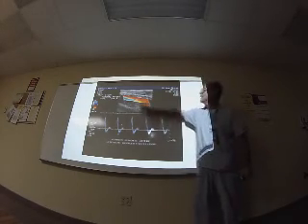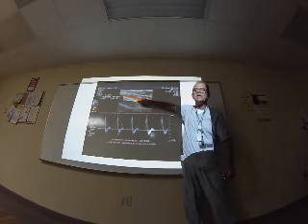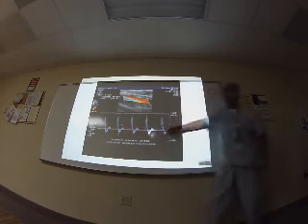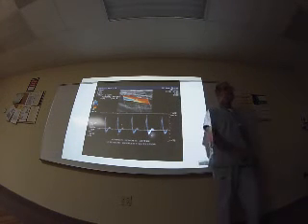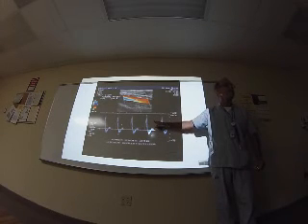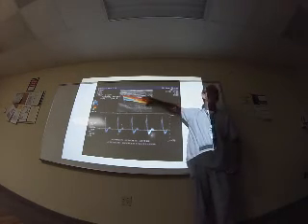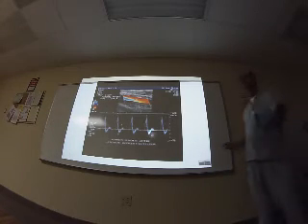This is the normal. This is B mode, color Doppler. The gate is here, and you are measuring the velocity here. You have here time in the horizontal and velocity in the vertical. Remember, do not confuse a spectral Doppler with M mode. They are totally different, but the picture is similar. M mode is to measure the heart beating.